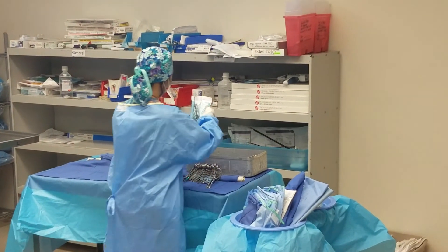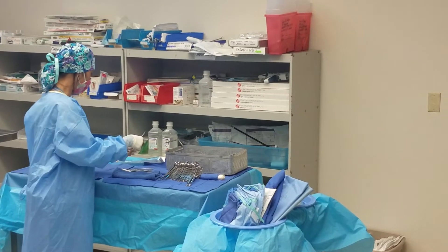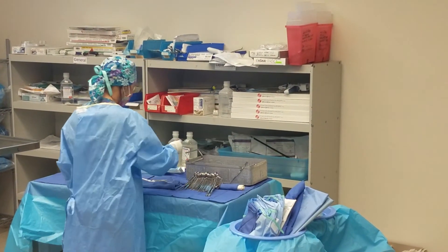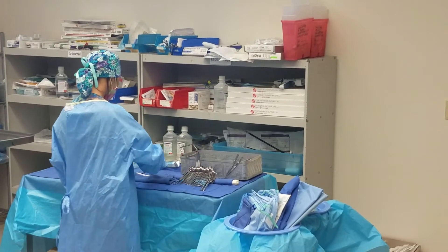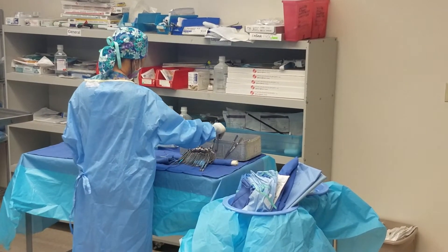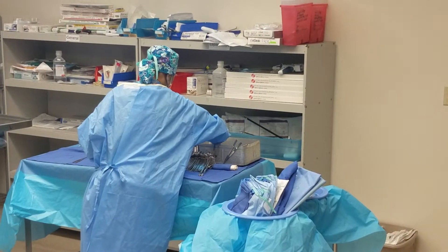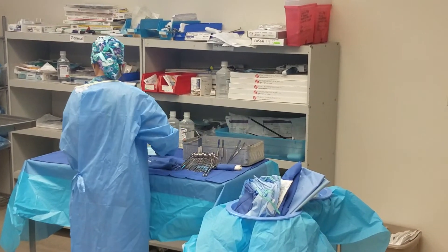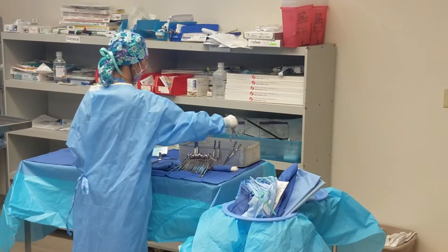So now what you have here is already arranged the way that we're going to count it, because usually on the count sheet this is what it would look like. So now I'm halfway done. These little things here — if it comes in a pack I usually pick it up and put it where I'm going to put it. So if this is like my sharp area where my knife is going to go — I'm picking up a DeBakey; I like my DeBakeys on this side. Another DeBakey — this one is with teeth, so maybe I'll put it on the opposite side. That's another DeBakey — so this one is Adson's without teeth, so I'm going to put it the opposite way. There should be two.